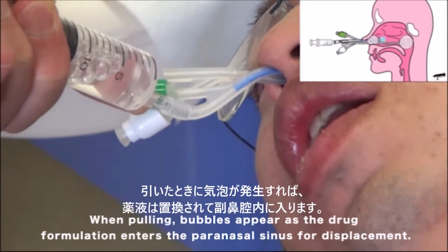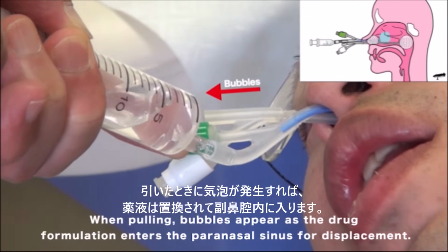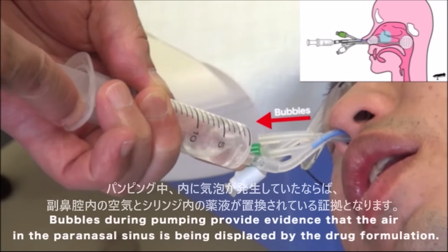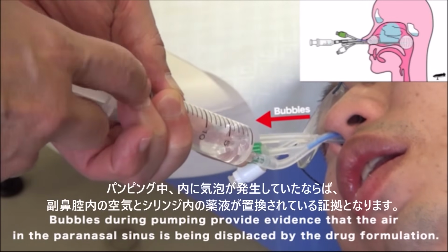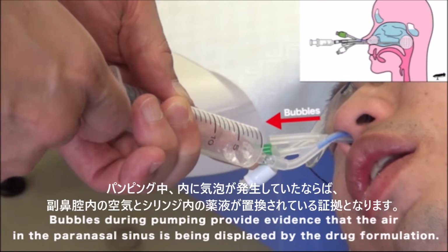When pulling, bubbles appear as the drug formulation enters the paranasal sinus for the displacement. Bubbles during the pumping provide evidence that the air in the paranasal sinus is being displaced by the drug formulation.